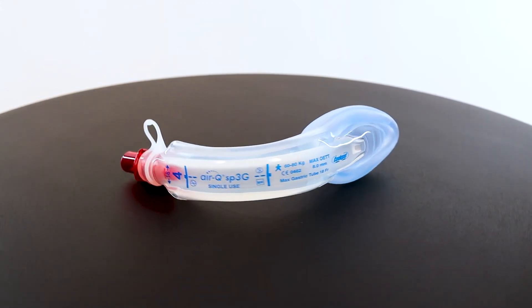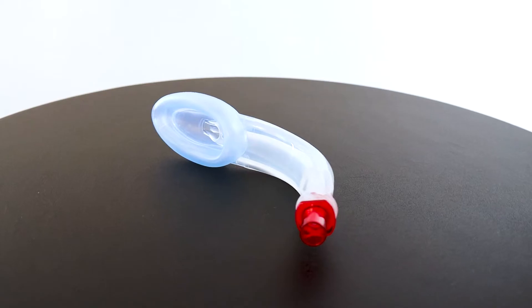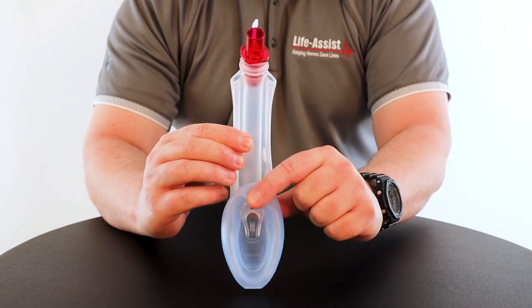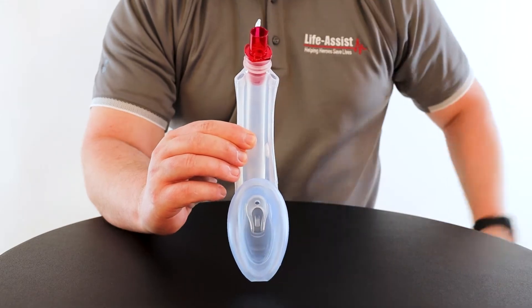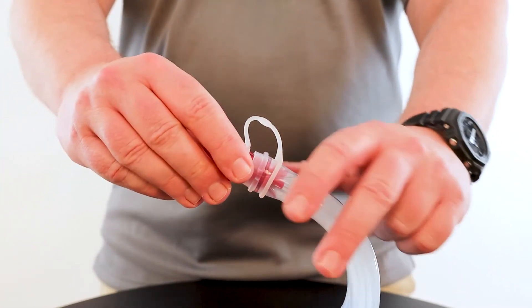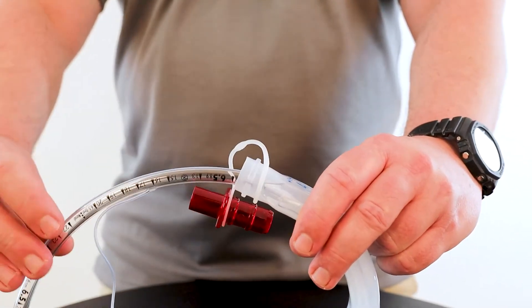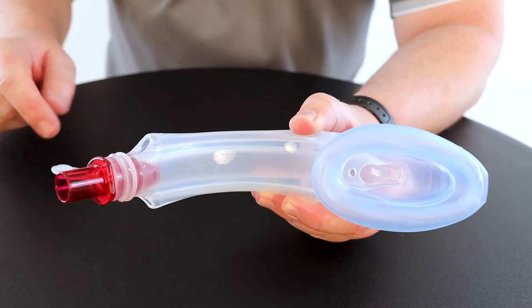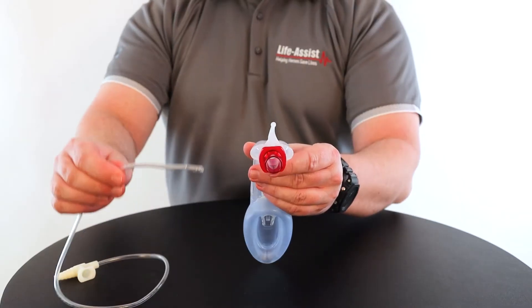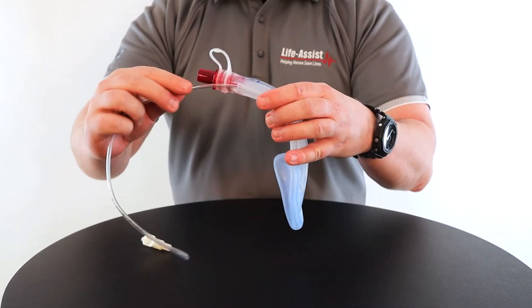At first glance, we are greeted with a color-coded tether connector, anatomically curved silicone airway tube, and medical grade soft silicone cuff. The color-coded connectors allow for easy identification and are removable, facilitating insertion of an endotracheal tube. An integrated bite block and two extra-wide gastric channels accommodate nasogastric tubes up to an 18 French size.